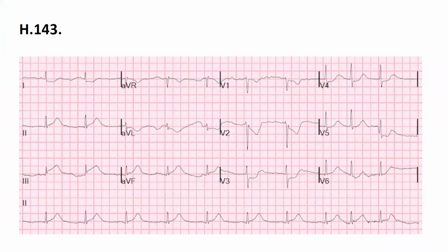So we have a rhythmic ECG. It is bradycardic because we have 1, 2, 3, 4, 1, 2, 3, 4, 5 squares. Actually, on about 5 squares, it's about 60 beats per minute, so not so bad. Let's see, P waves. I see P waves in lead 3. Also in AVF. Yes, we do have P waves, and that's a P. So I guess we can call this a sinus rhythm then.